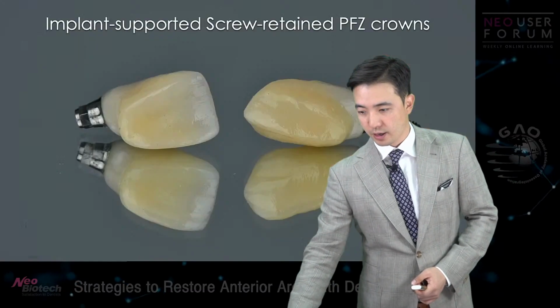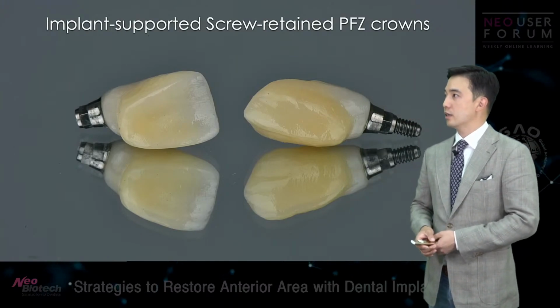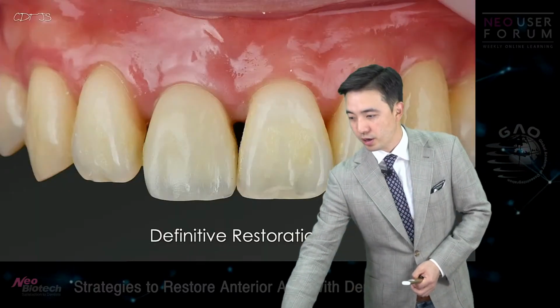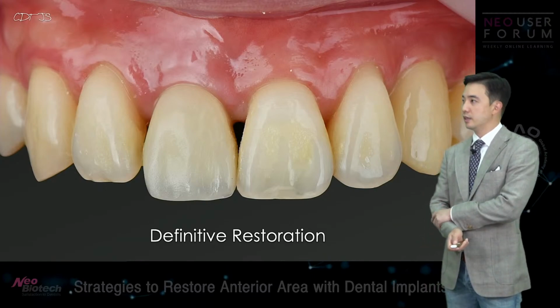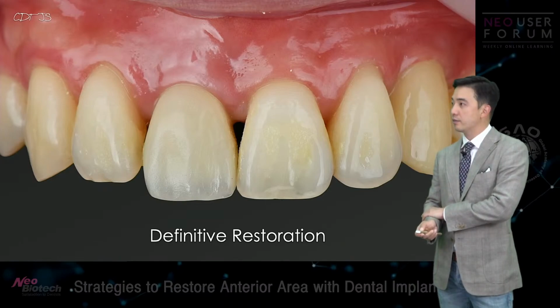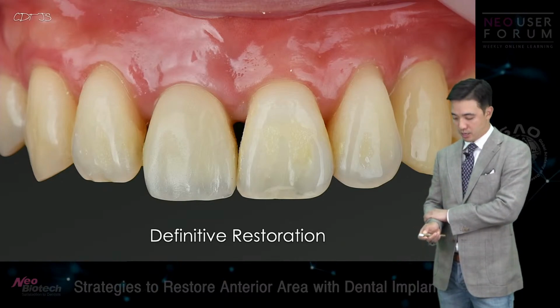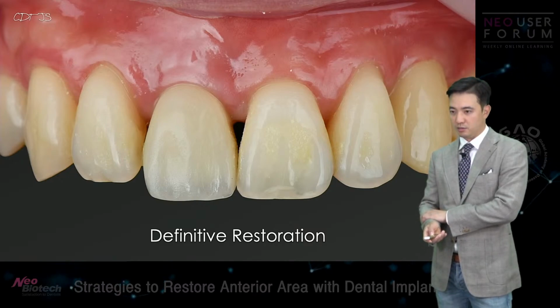Okay, we're back at the case. For this particular case, implant-supported screw-retained PFZ crowns were fabricated and delivered, right? Not bad, huh? I did have a little bit of loss of papilla here, I would say, but no big deal.